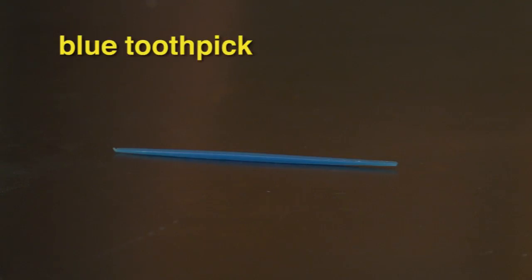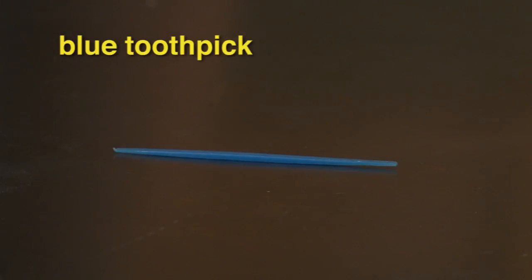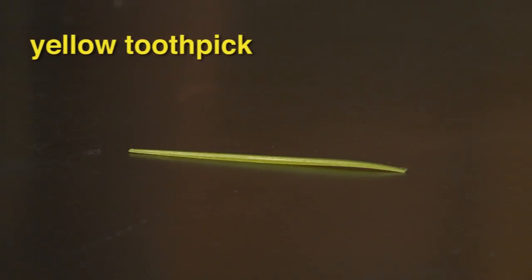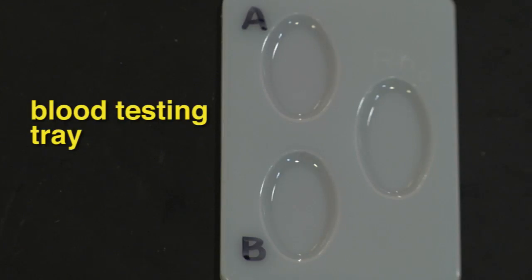In addition to the blood samples, you'll need a blue toothpick, a yellow toothpick, anti-serum A, anti-serum B, and a blood testing tray.